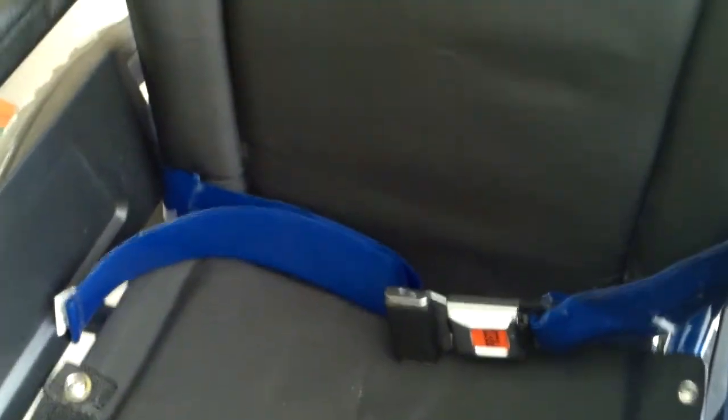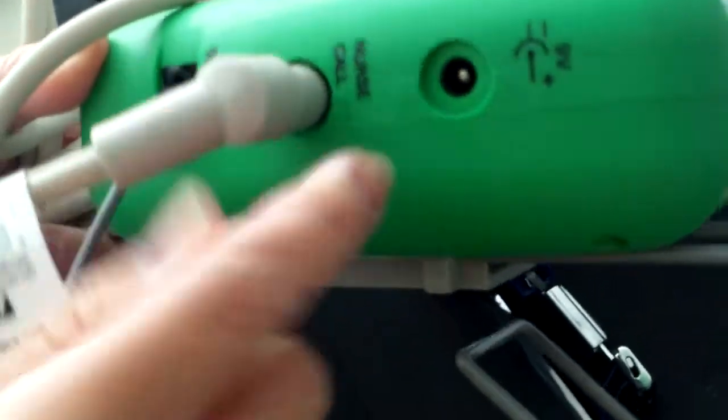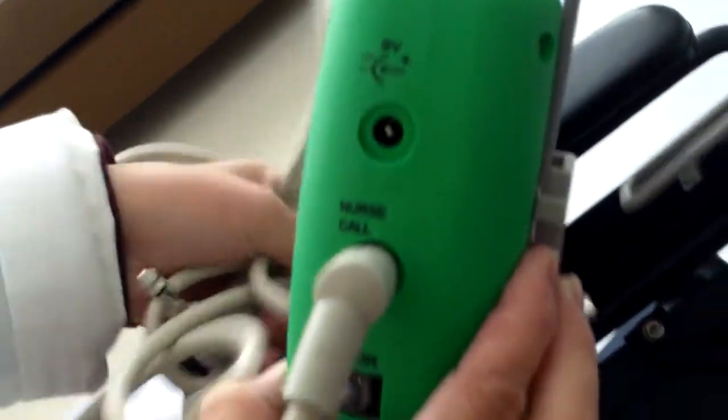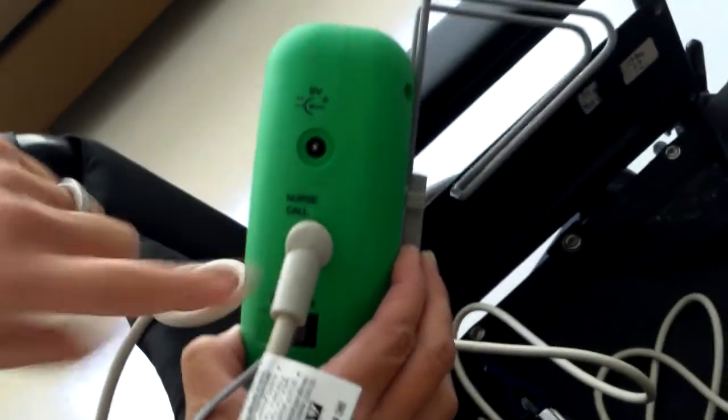Okay, so as you can see, we would have the seat belt, no different. It would be attached, and then we will continue to have this on the back. We would continue to have it turned on, so just have it on the on mode. The difference is now you push one end into the call system, and it's labeled nurse call. It won't fit into this side and it won't fit into this side. It's only one hole it will fit in, so it's very easy to use.